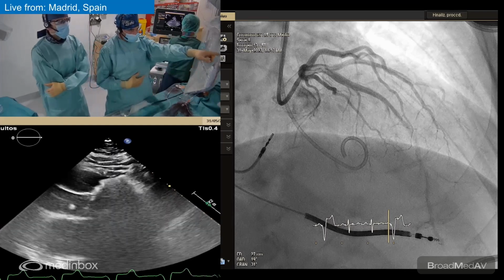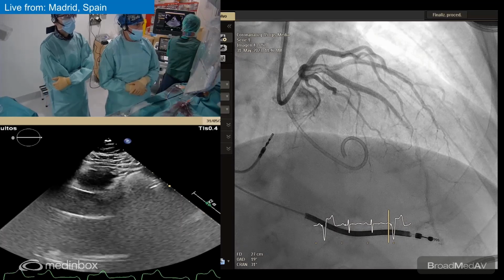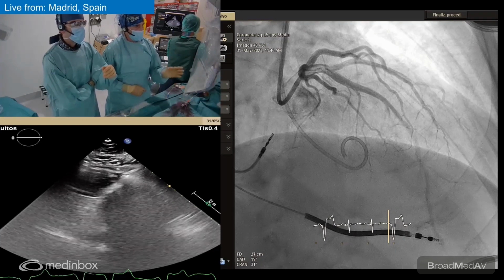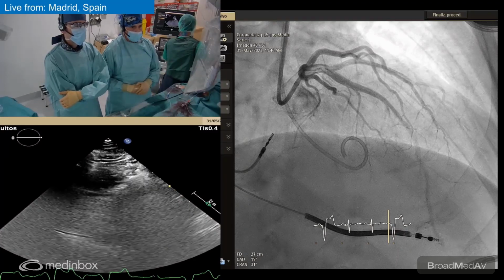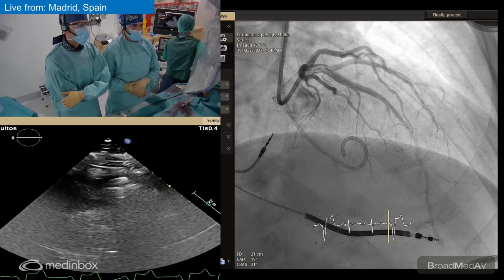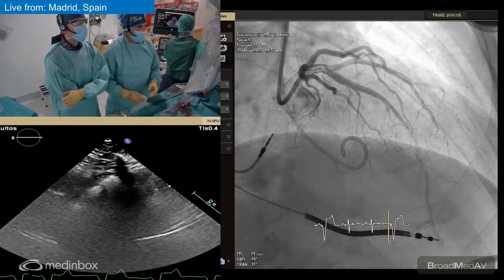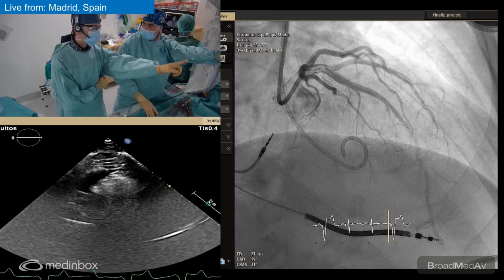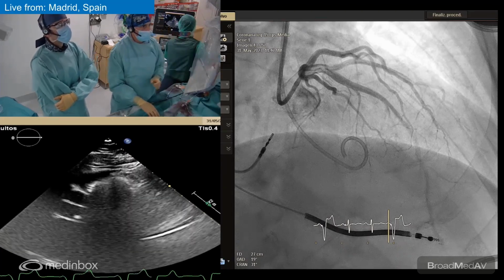I think if we have time, we should test the first septal. It is the smaller, but sometimes it's not a matter of the amount of contrast. The main factor is the place, the accurate precision to ablate the more basal, the more superficial endocardium near the contact of the systolic anterior movement of the anterior mitral leaflet. And you mean the first one or the first we treated? No, the first one that we entered, the one that is before the first septal.